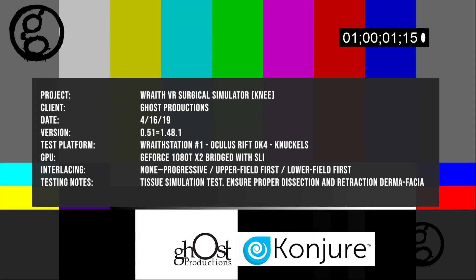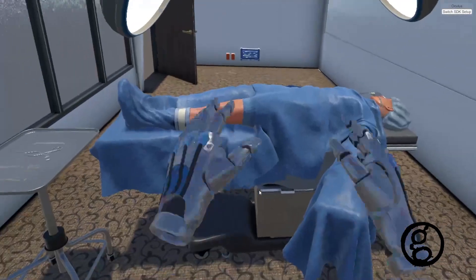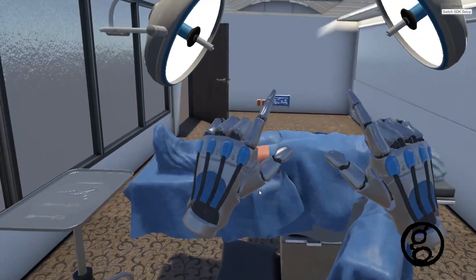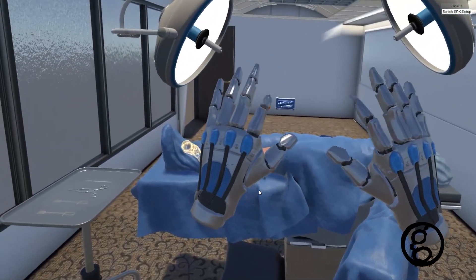Welcome to the Virtual Medical Training Simulator. In this simulation we will be performing a total knee replacement surgery.